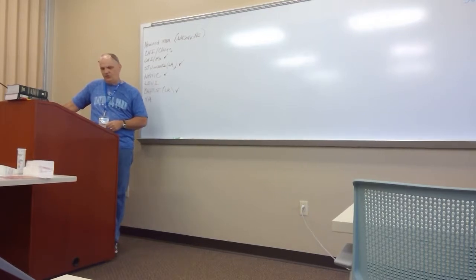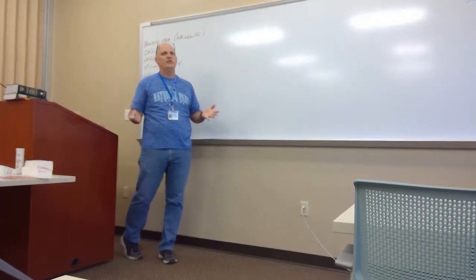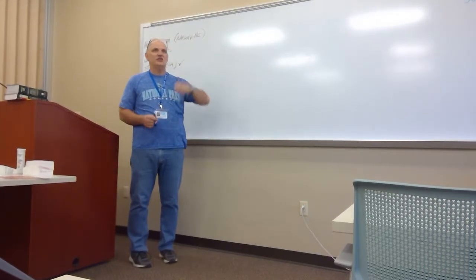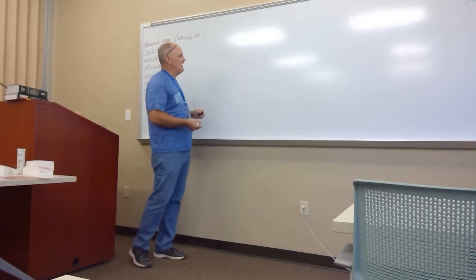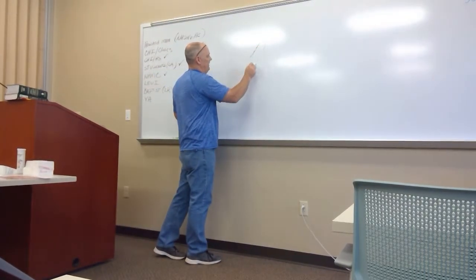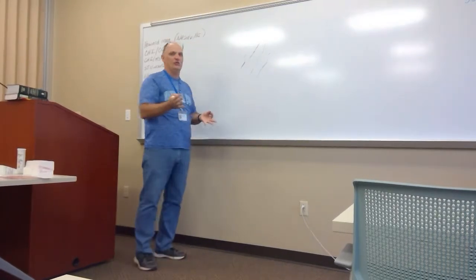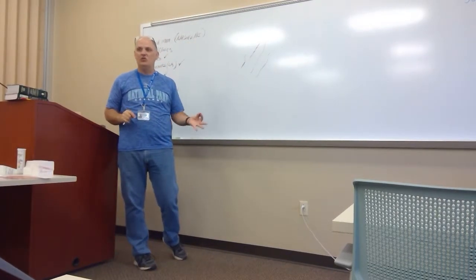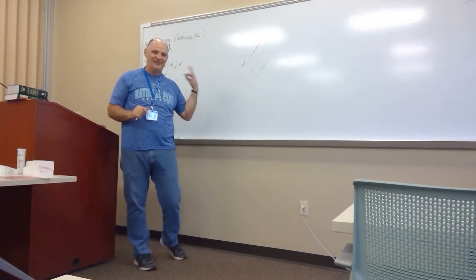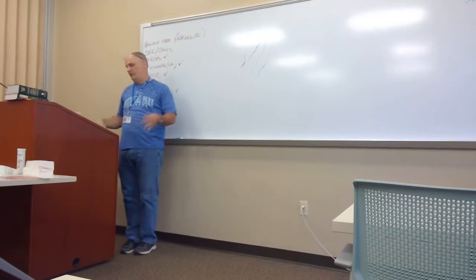Mucus on page 120 in the right-hand column. Mucus, you have to note if you see it, it's not that it's a contaminant, but a lot of times mucus is just going to be like real fine, stringy lines. Sometimes it just obstructs your view. Sometimes mucus can be heavy. Sometimes it's not. I don't like the picture that your book has, but we'll go with it.